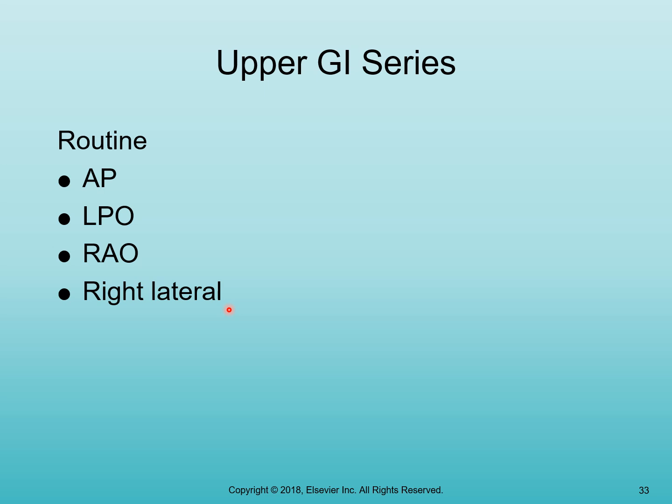What is meant by that? It means those are the images that are taken after fluoroscopy. So remember, fluoroscopy is radiography in motion. These images are still or static images, meaning they're like a photograph, whereas fluoro would be like a video. So these are the 4 images that we would take on a patient, and we would go in this specific order.